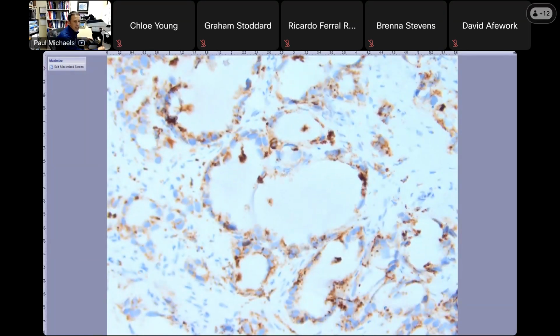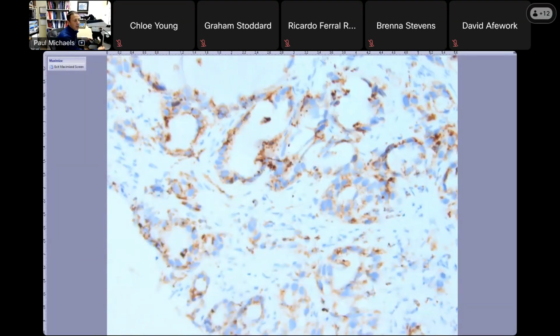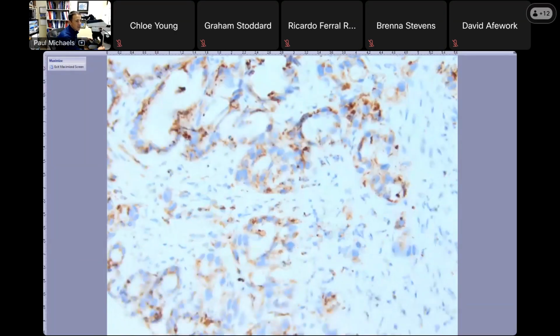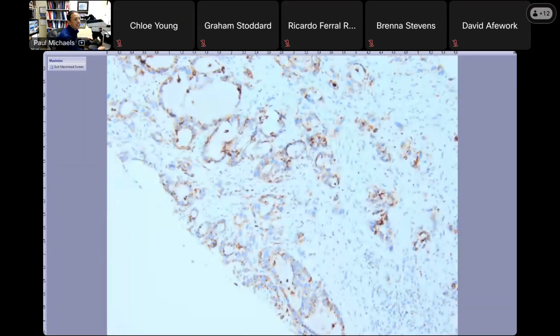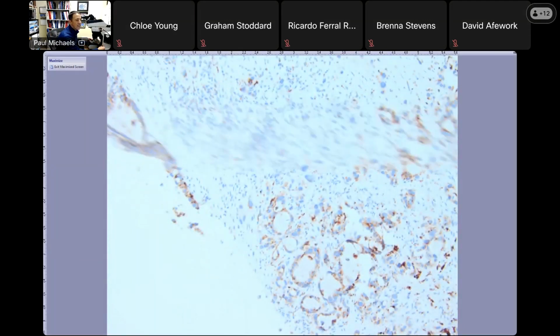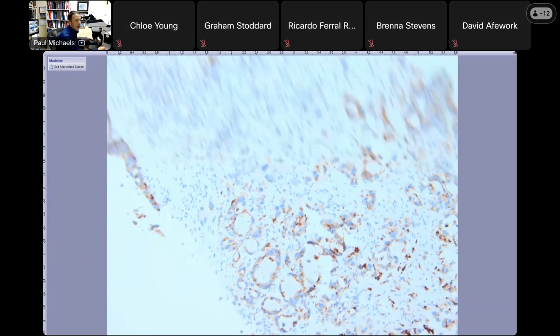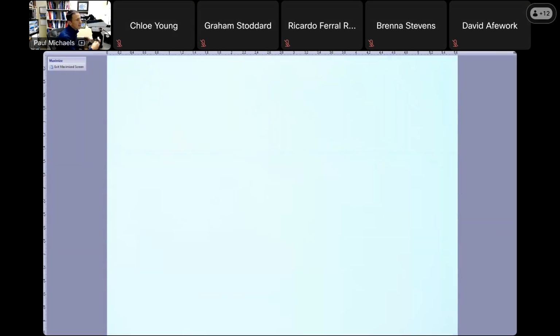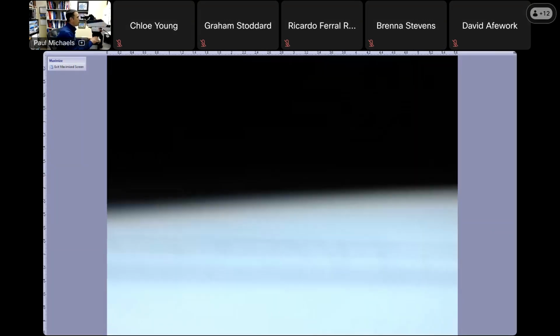This is really, really rare. Less than 1% of kidney tumors are metastases. 90% of metastases to the kidney have a history of malignancy. This one did not. So this is a rare tumor, and it has a rare presentation because the patient did not have any known lung tumor. And so they scanned the chest after this and found an upper lobe lung adenocarcinoma. So again, a very weird, rare presentation, but you just have to go through the motions to figure out what this is.